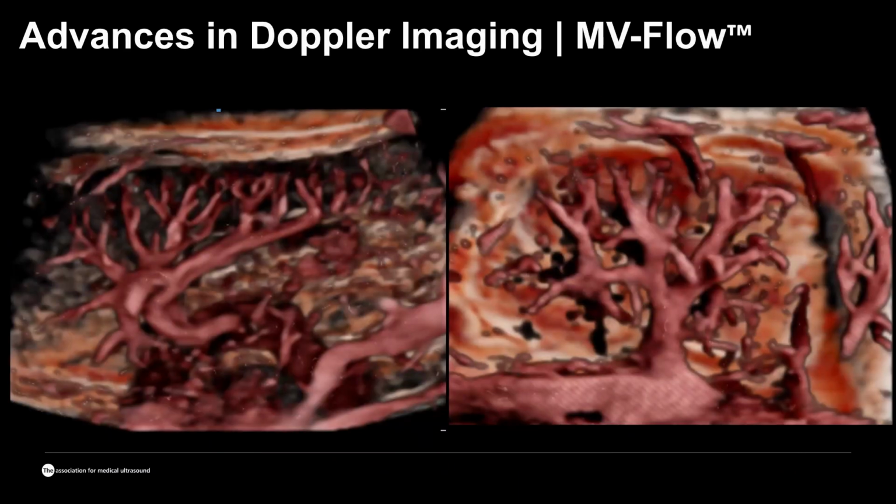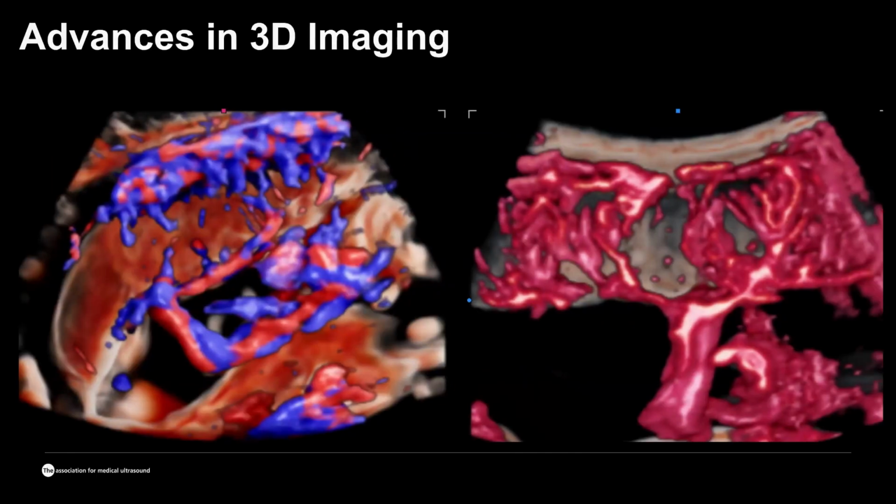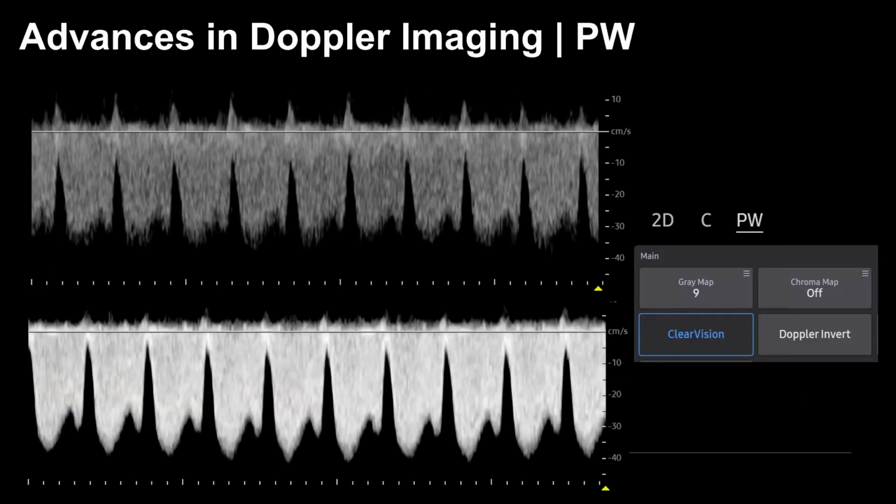So we can also reconstruct the vasculature of the different organs. This is the baby's kidney, which shows a very good perfusion of the normal kidney. And this is the perfusion of the spleen, which is huge because this baby has a CMV infection. We also have a lot of research going on in our department in the evaluation of the placenta and placental imaging. And again, those technologies can be used for that.